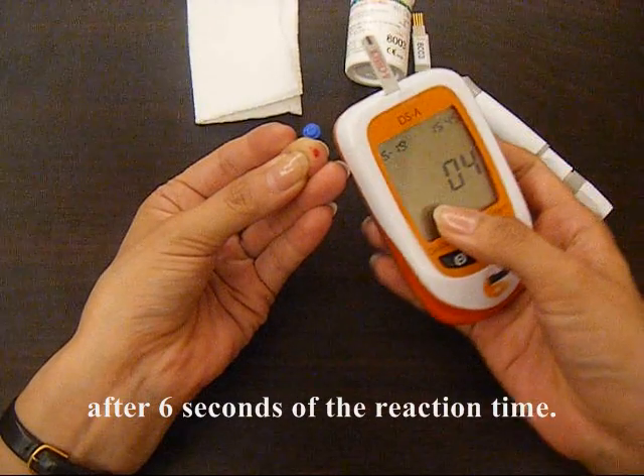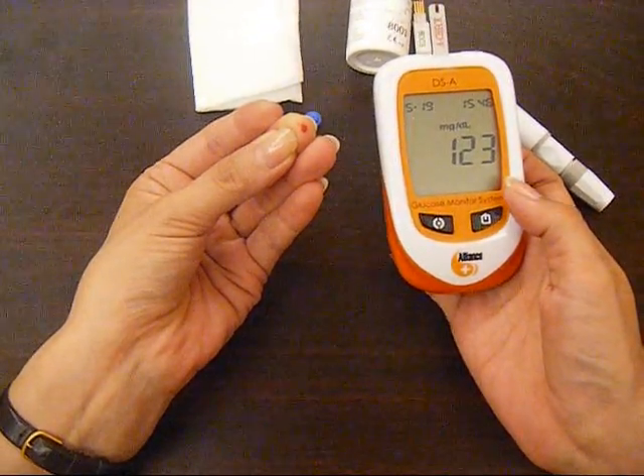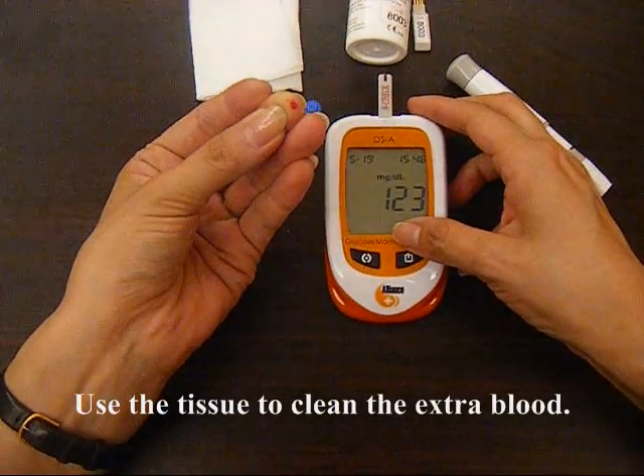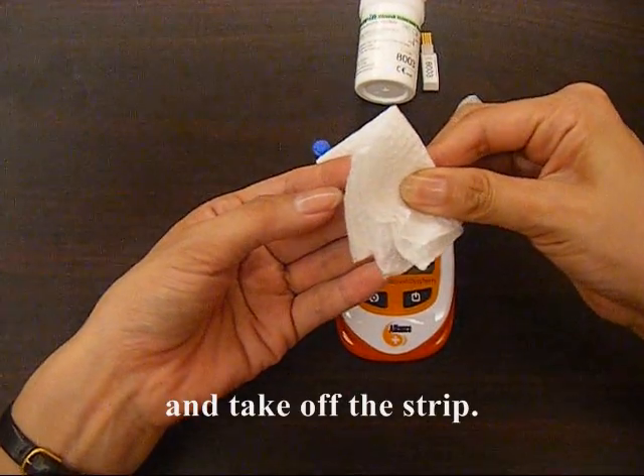Get the result after 6 seconds of the reaction time. Use a tissue to clean the extra blood. Take the cap and take off the strip.